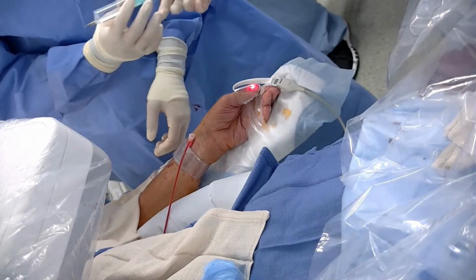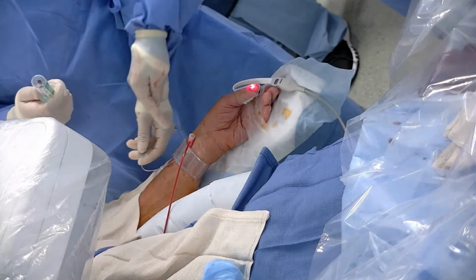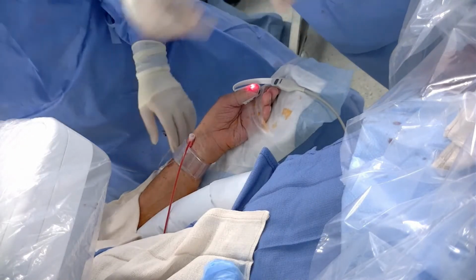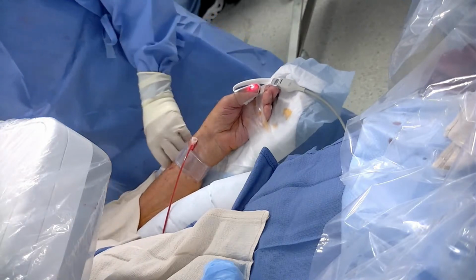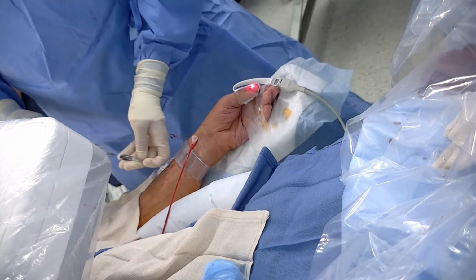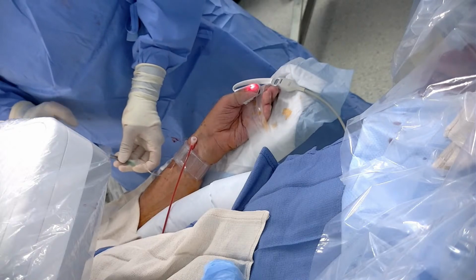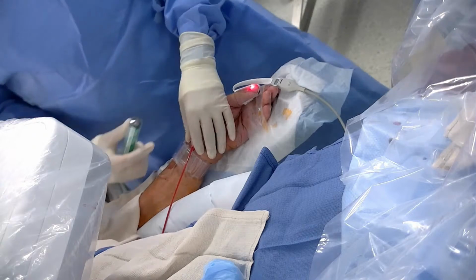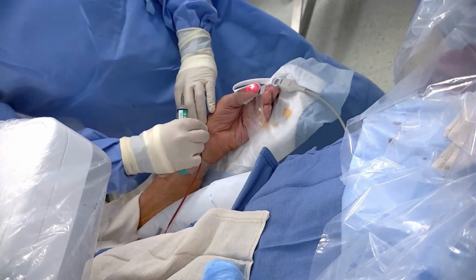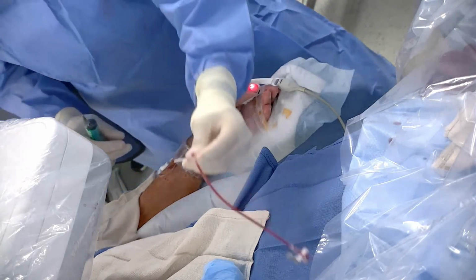And then you're going to put how much? So what he's done is there's a green dot on the TR band, which he's placed over his entry point into the artery. It's a little hard to see, but there's a little green dot. Then he put the Velcro on as tight as he can, and he injected about 20 cc's of air. Still have a waveform? Yes, we still have a waveform here, so he's going to take out the sheath.